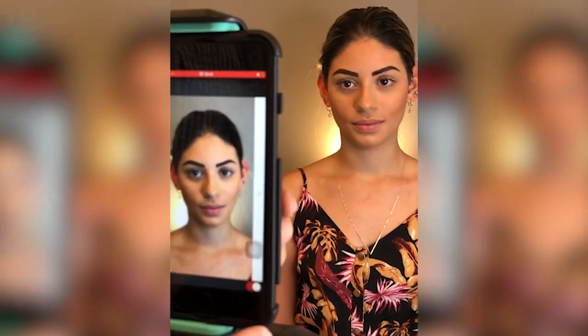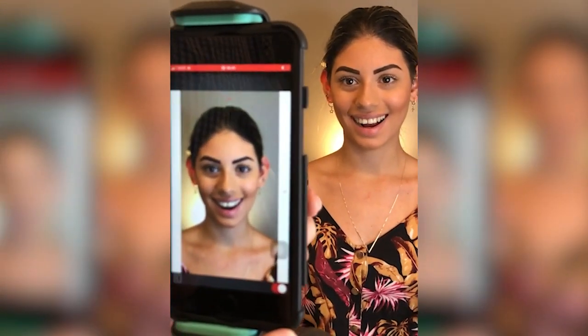Taking the perfect frontal facial picture of your patient is probably the most important step in the smile design process. The reason for it is, 1. You are using this picture to understand the overall symmetry or asymmetry of your patient when it comes to the correlation between the facial and dental components. And 2. You're giving the right information to the artificial intelligence of DSDApp to generate the automated facially-driven smile simulation.